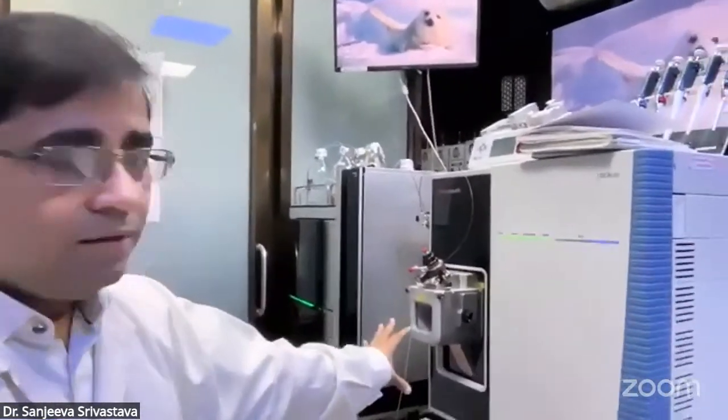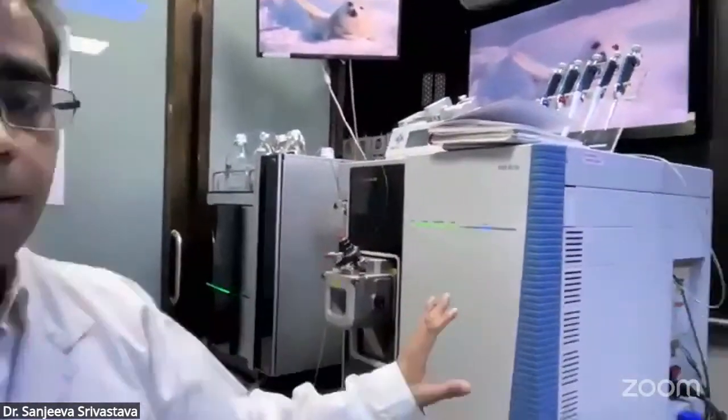Then we have the ESI, and then the triple quadrupole mass spec, which can be utilized to screen a specific set of metabolites or proteins and peptides. This gives you some flavor of the different tools available in the lab, which we utilize for different workflows in clinical proteomics and multiomics.